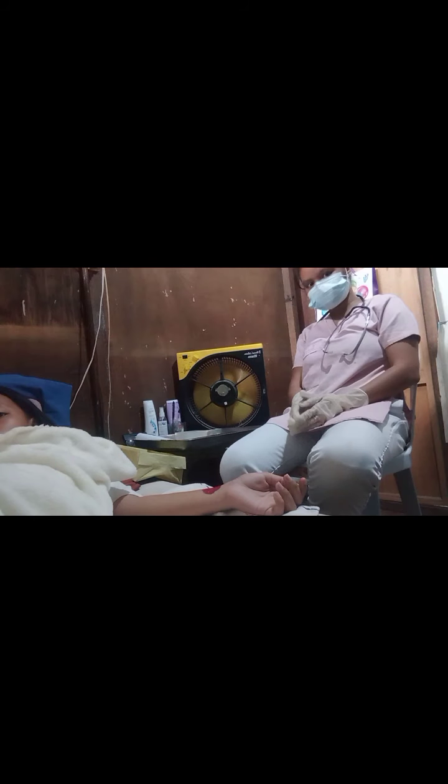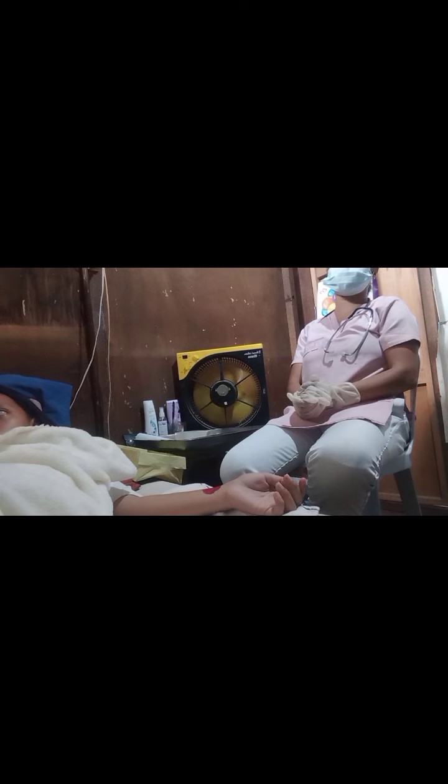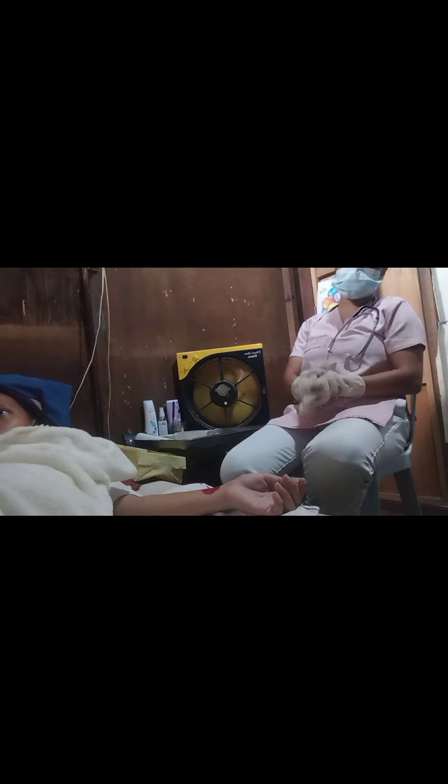There are things to remember. If a wet to dry dressing becomes stuck, do not moisten it.